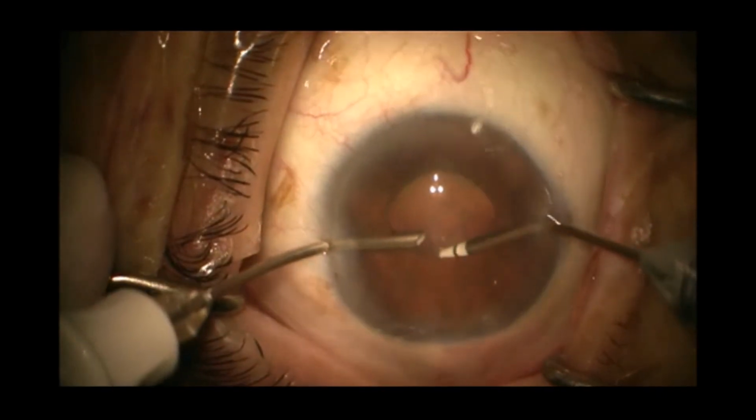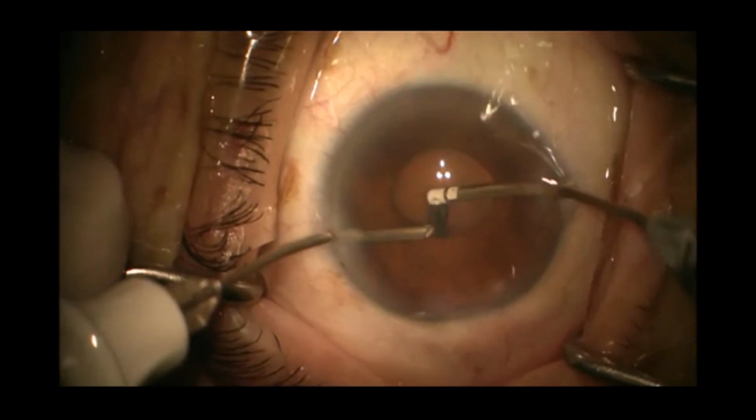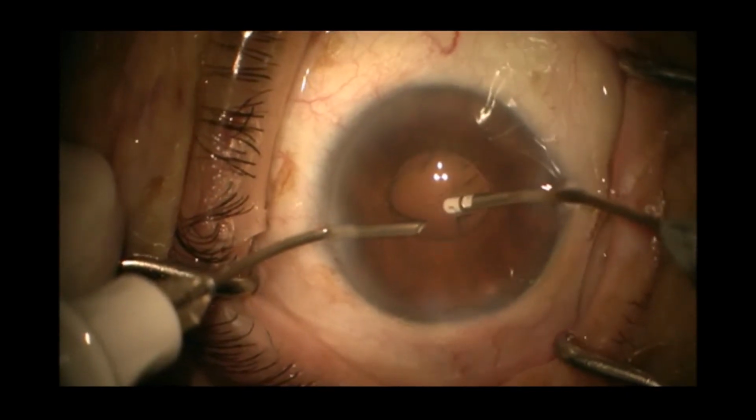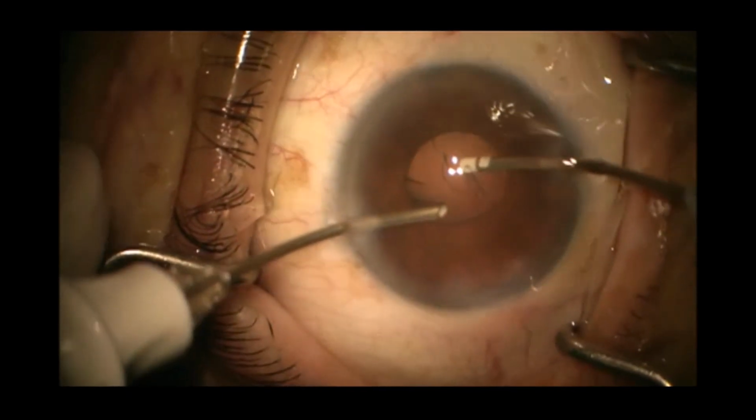I use bimanual now. I was not very comfortable at some essential point because of the inadequate pupillary dilatation. I remove the subincisional cortex with my bimanual irrigation aspiration.